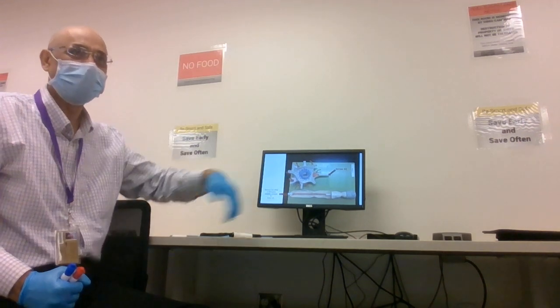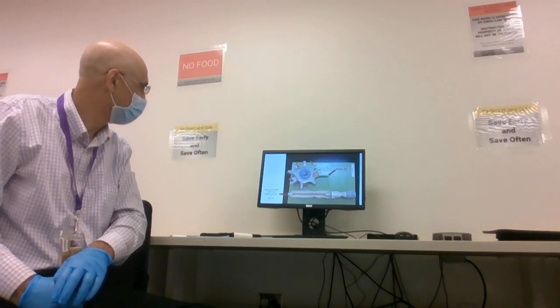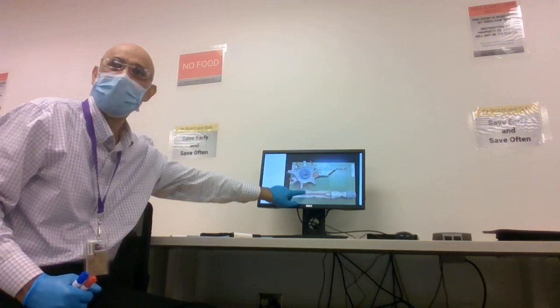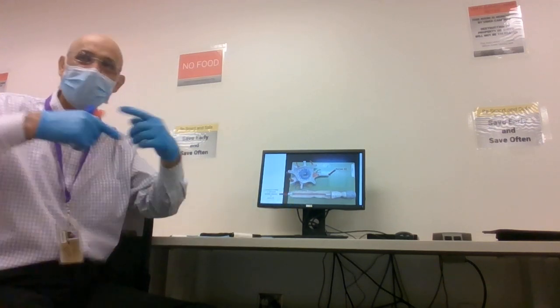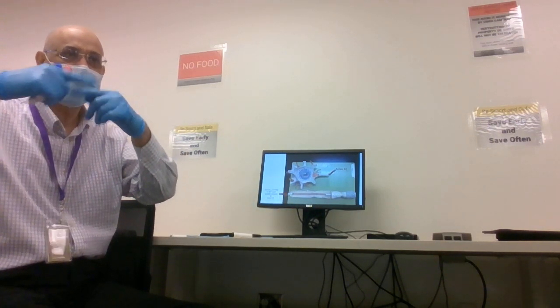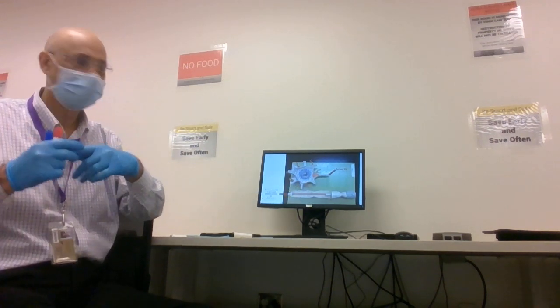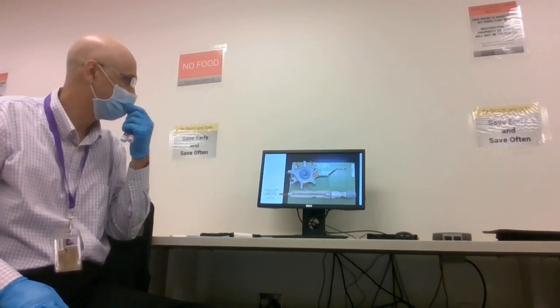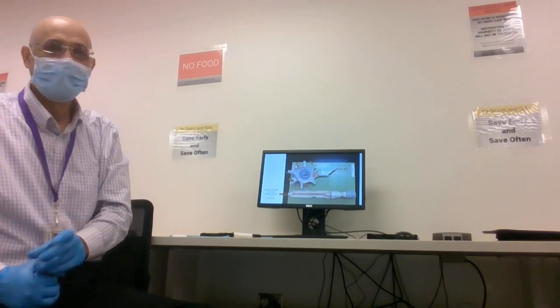You guys good? They're a really good model, right? You definitely get it. What's that little pink thing on top near the neurolemma? That's the nucleus. Nucleus of the Schwann cell, right? Remember, the inner layers are really tight. You don't see any cytoplasm there, and this nucleus is pushed to the side. Makes sense? Here also, right? You good?